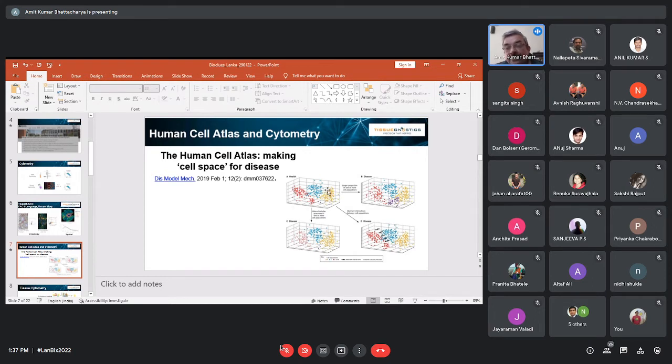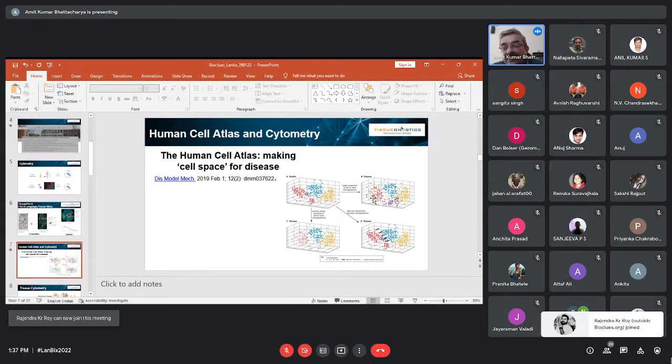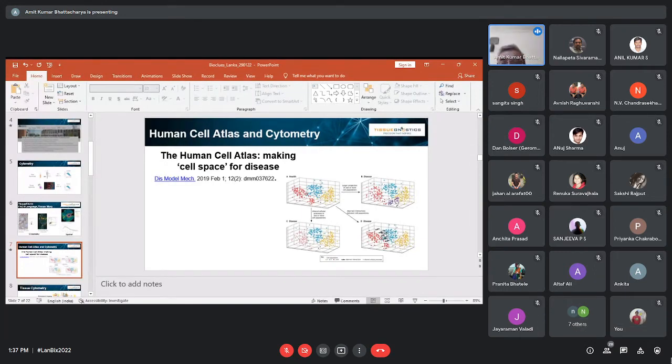There will be a particular population and subpopulation profile in a healthy individual, and then depending on the disease the healthy individual encounters, there can be population drifts. There can be drifts in the cell numbers, or there can be creation of new subpopulations of cells, or even for the same disease, depending on the course of the disease, there could be different population changes, and these population changes could be affected for different reasons. They could be affected by a change in cell-cell interactions. It could be because of, let's say, a new phenotype appearing, for example.